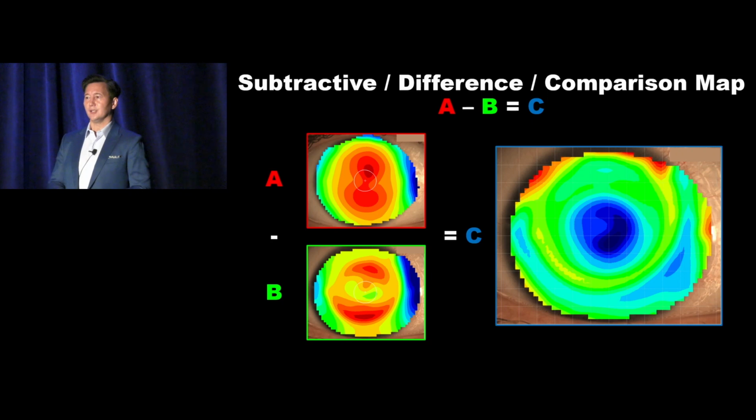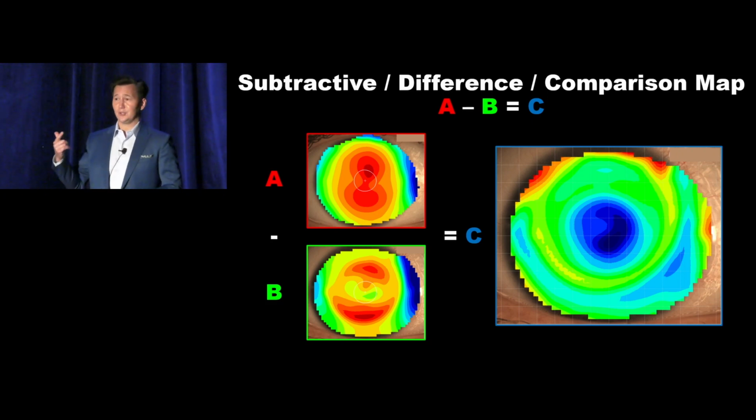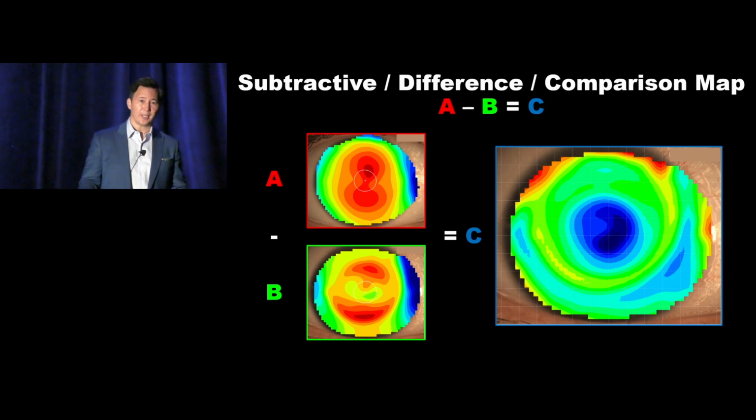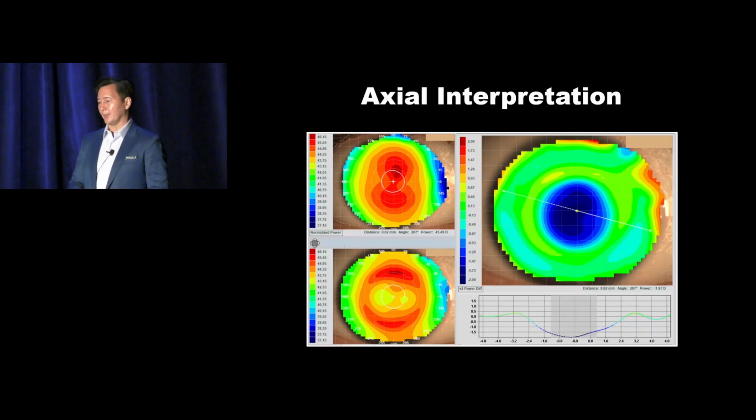It's much different than conventional corneal GPs where we might steepen the base curve or flatten the base curve. We might go larger or smaller. But with an ortho-k lens, there's many things you might do. You might alter the base curve, you might change the reverse curve, you might change the alignment zone, you might change the toricity, you might change the diameter. So you must know what's happening with these post-wear maps.